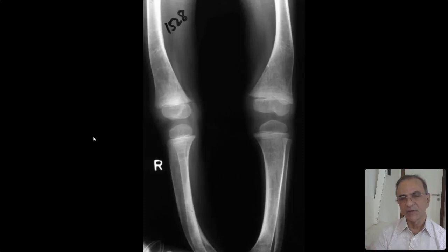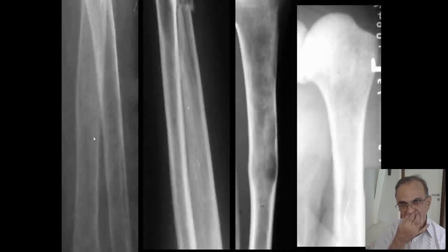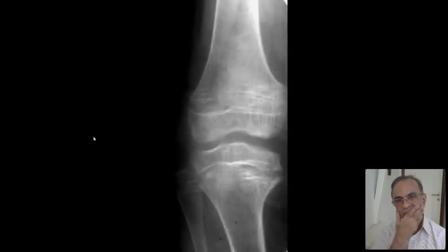You could do calcium levels, you could do vitamin D levels. If they happen to be abnormal, you could treat. By and large, those are normal. These are tombstones of disease that was present long back. Okay, so the important thing here is that this is not a skeletal dysplasia. So I talked to you about texture of the bone. Let's move on. Now this is, pay attention, wake up.